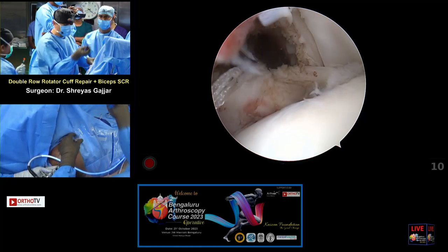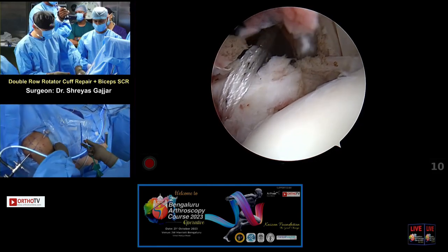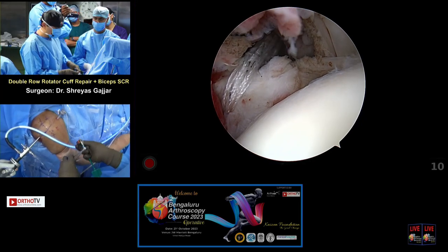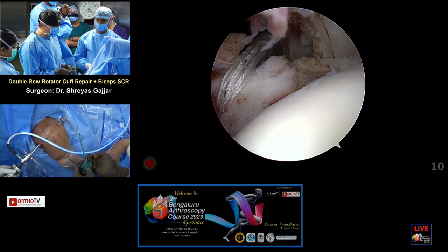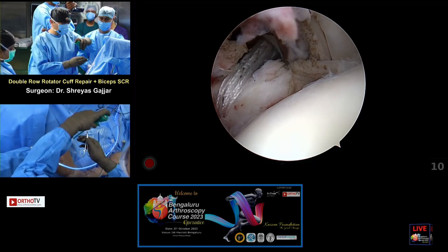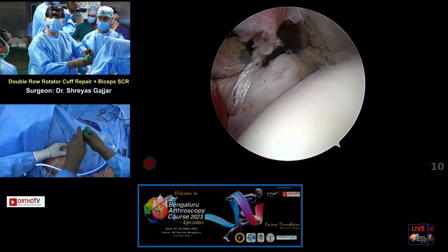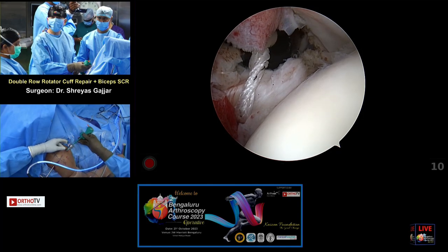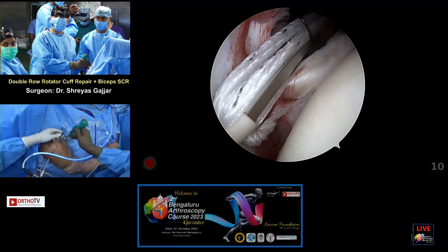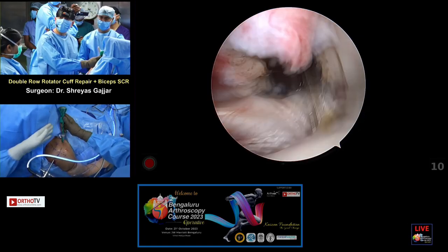And then, if you have the outside image, have you got it? Yeah, we are able to see the outside. Okay. I'm just going to use the BioComposite 4.75 SwiveLock anchor, which is the workhorse for my rotator cuff surgeries. It's got a PEEK eyelet, so we're just delivering the tape through that. Now in knotless anchors, one important thing is that you don't want to over-constrain. So what I tend to do is a little bit of pass pointing, so you have a little bit of slack before you insert the anchor into the desired area, as seen here.